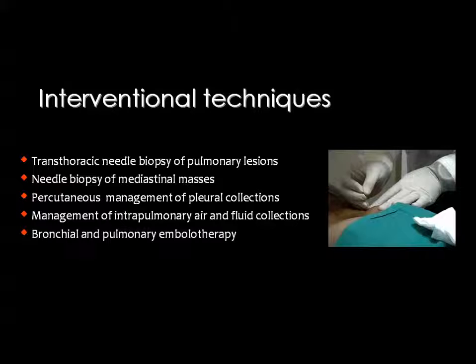The interventional techniques we usually perform in the chest include the most common procedure, which is the transthoracic percutaneous needle biopsies of pulmonary parenchymal lesions, also the biopsy of mediastinal masses, and the percutaneous management of pleural collections, as well as management of intrapulmonary air and fluid collections, and finally the pulmonary interventional angiographic techniques, including the bronchial and the pulmonary embolotherapy.